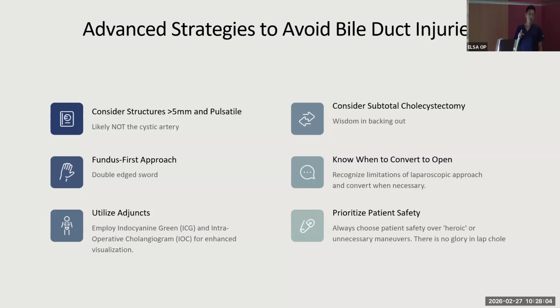The ICG, if it's available, that's best. Intraoperatively, if you decide that you need it, the dose that I give is 0.25 milligrams, very low. Then the scrub nurses will keep asking, are you sure it's so low, because dilution is a lot. They dilute it a lot to give the correct amount. The reason why it's low is because we want to delineate only the biliary system. If you give more, the whole thing is bright and you can't see anything. Best is if the ICG is given preoperatively at reception, you give 0.25, and then intraoperatively it will nicely show.